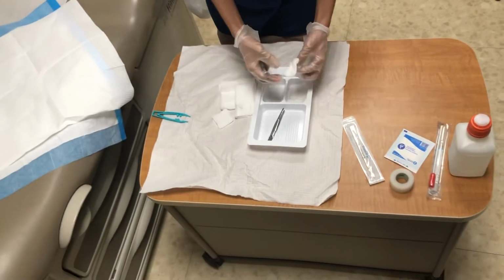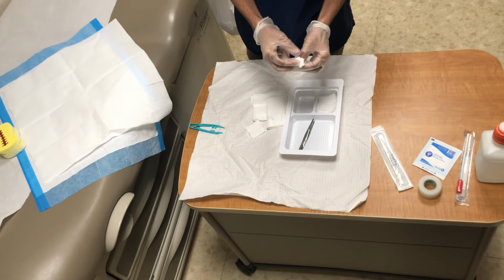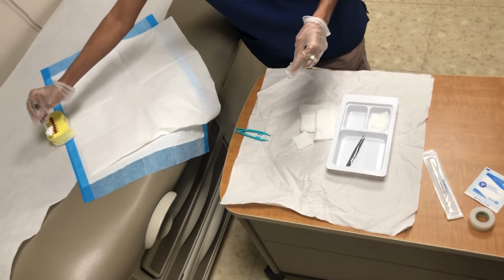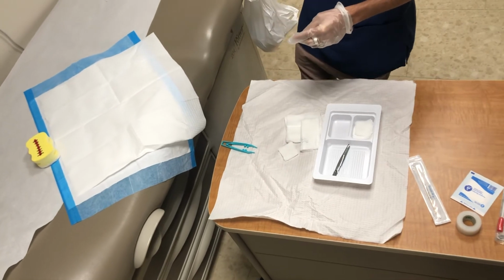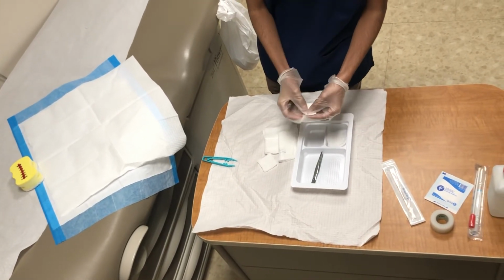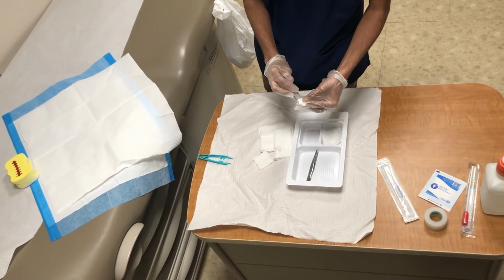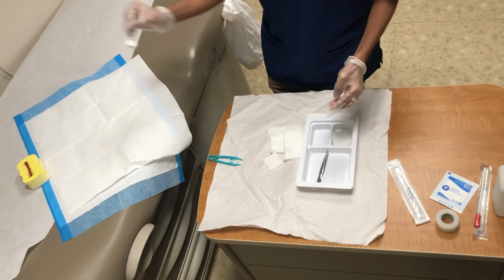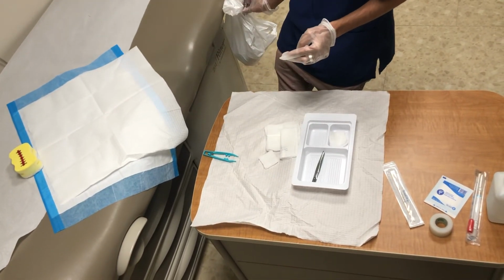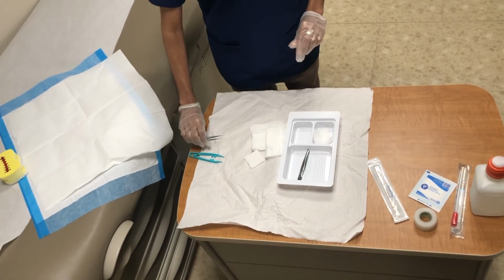I'm gonna do this again for another one. I'm making like a dumpling. And then I'm going to clean again. Side, garbage. And we're gonna do another one. Squeeze it. Use my sterile forceps. Other side, garbage. So both sides. And then I'm just gonna put this onto my field.